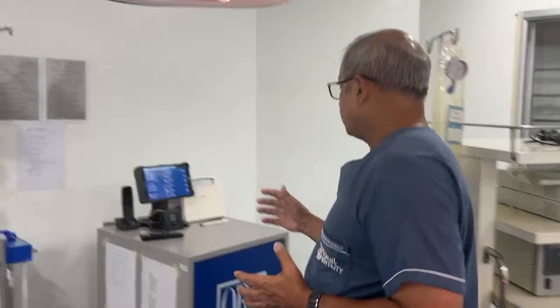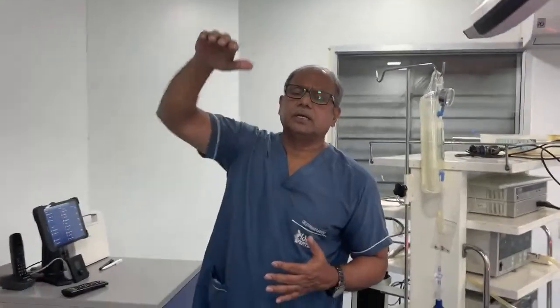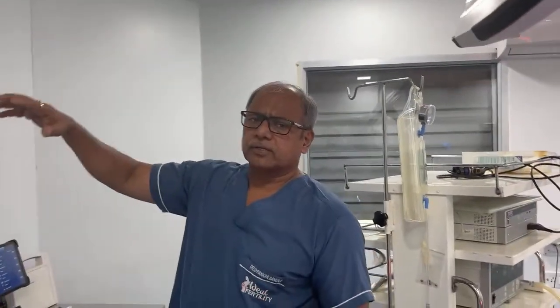This can be shown to the patient live before transfer. So it creates transparency, and a lot of things when we do ovum pickup and all can be done through this OR1 system, which I integrated through this very important system. It has an audio system above where I can talk to my patient from outside. I can talk to my workshop people, through which we will go to the auditorium now, where the endotrainer is kept, and this endotrainer will be shown by Devkriti.